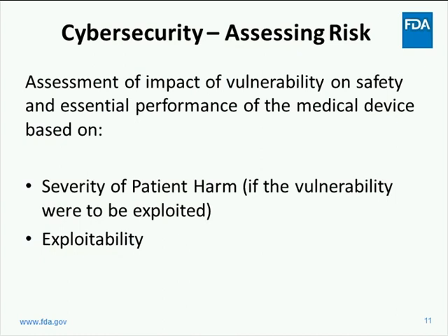Combining the concepts provided in ISO 14971 and CVSS provides medical device manufacturers with a repeatable methodology for assessing risk of patient harm due to vulnerabilities within medical devices and accessories, while ultimately providing a triage tool for the prioritization of remediation, as well as cybersecurity routine updates and patches.